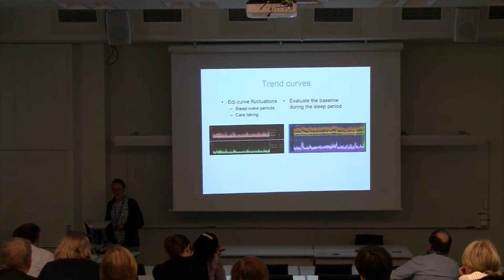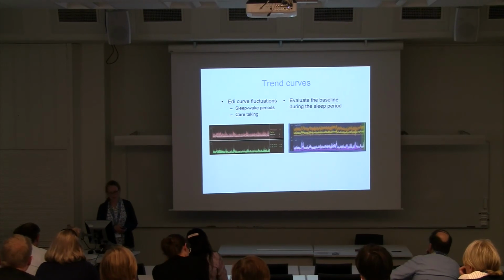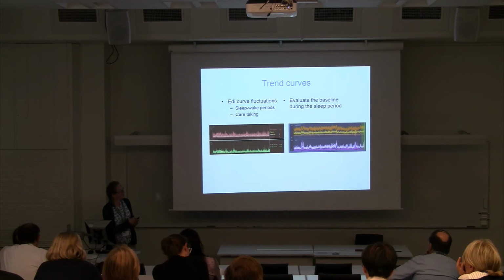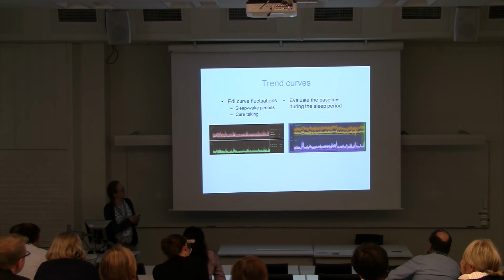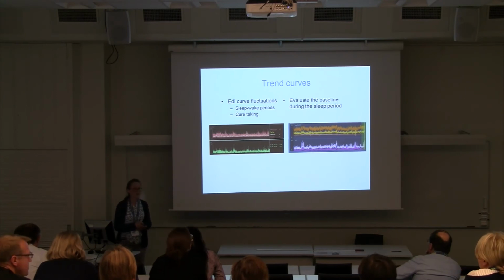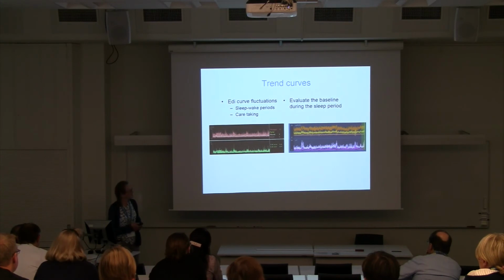And here you can see again some more of these trend curves. This is the pressure and the EDI curve. You can see that it fluctuates, and we learned quite fast when we started using NAVA that we can see when the nurses are taking care of the babies, every 3 hours you can see a peak in the EDI peak value when they wake up the babies.